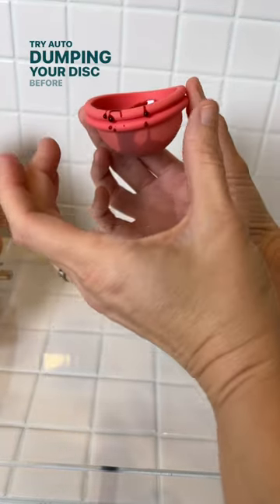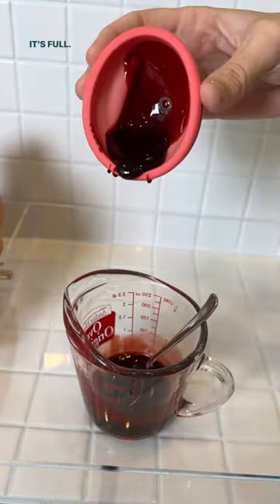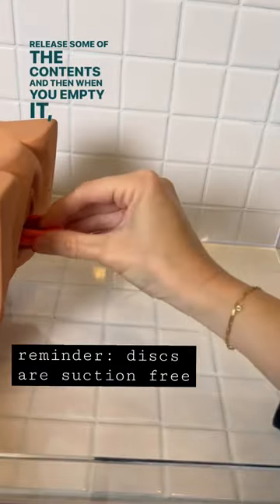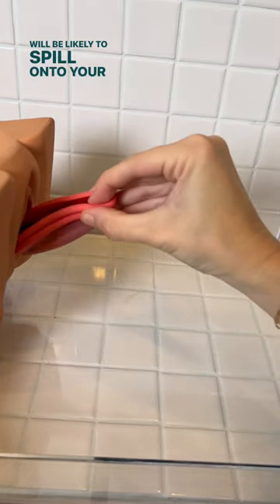Try auto-dumping your disc before you remove it, especially if it's full. Push against the disc with your pelvic floor muscles, release some of the contents, and then when you empty it, less will be likely to spill onto your hands.